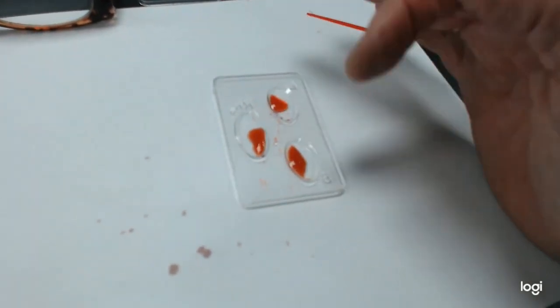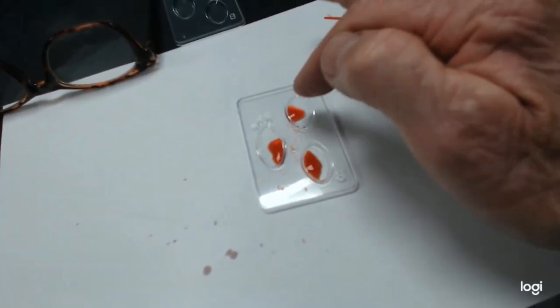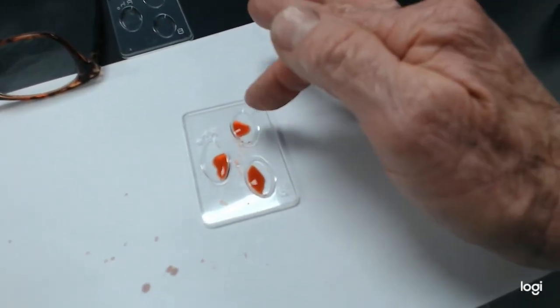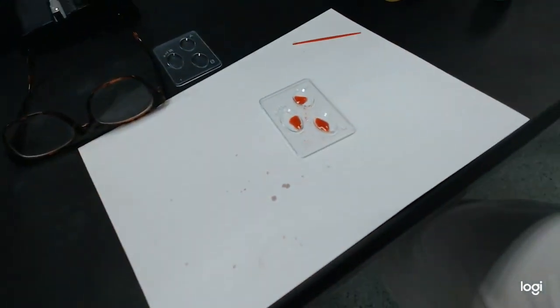If this didn't clot, it would be B negative. If this one only clotted, it would be A negative. If that and that clotted, it would be A positive. Okay, so that's a good start on that.